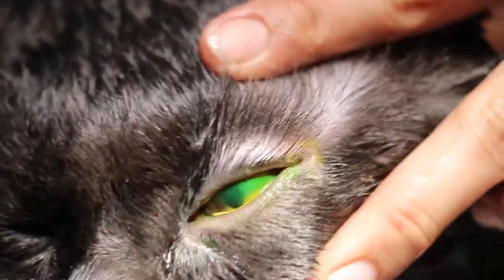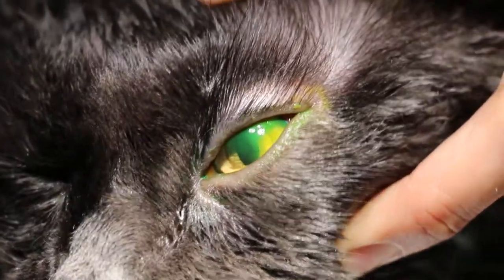Almost the whole cornea has been stained green. That's the ulcer area on the left eye — very clearly on the left side, from 12 o'clock to 3 o'clock.